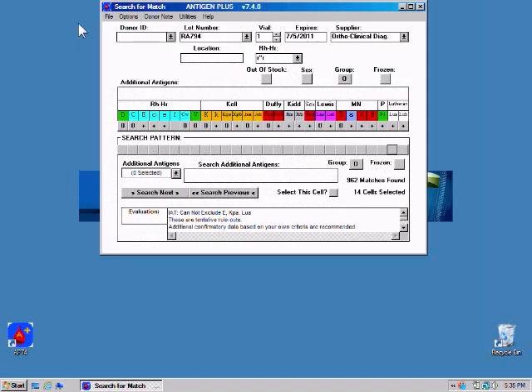Exit the results panel, and on the main page, our evaluation has been maintained below, so we know exactly which antigens we're looking for. Since we know that we have a big E, we want to search cells that are negative for big E. Then we go to our 2 lows in question and start by putting in zeros, because at least then you have the columns selected and are less likely to make a clerical error. Starting from left to right, my first one is the KPA, and I want a cell positive for KPA and negative for the other 2.